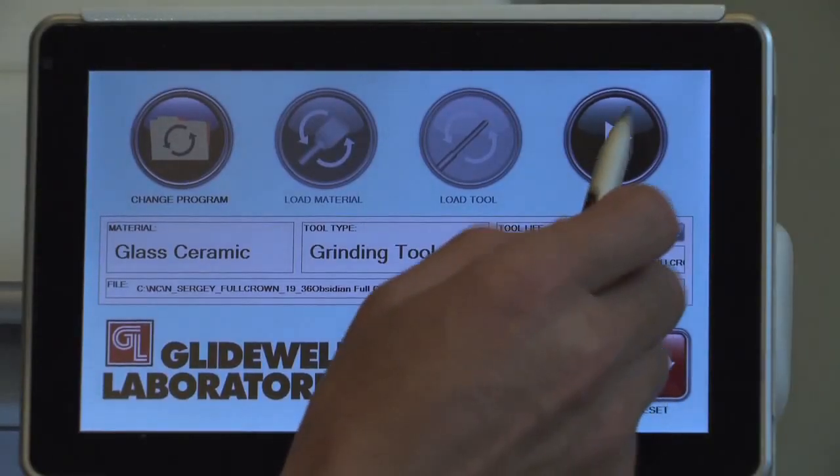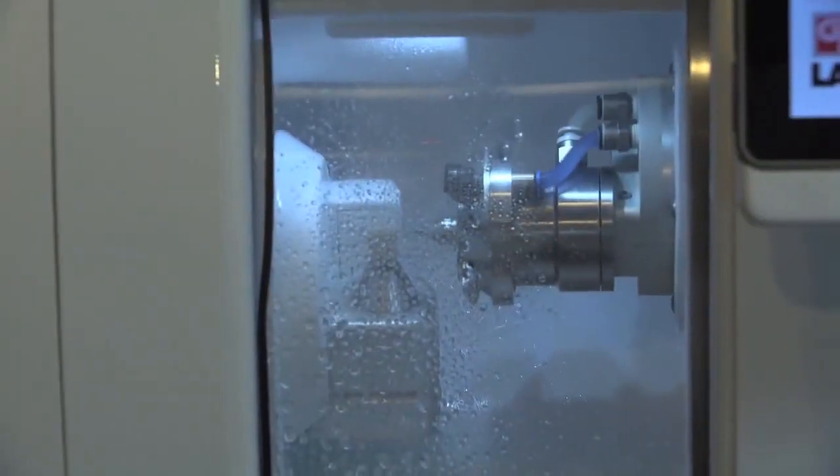To start the milling process, press the Start button. Once the mill has started, it will proceed until the restoration is completed. Now that the spindle is rotating at its cutting speed, if necessary, the air pressure should be readjusted to 70 PSI.